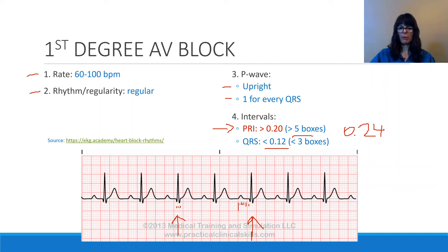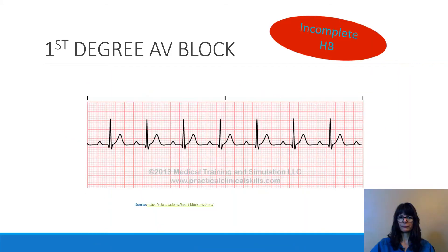In a first-degree AV block, basically everything is normal except the PRI is prolonged. Looking with the naked eye from the thick line at the beginning of the P to the beginning of the R, we can already see this is greater than one box from the thick lines. So we already know this is a first-degree AV block because the PRI is greater than 0.20 seconds.